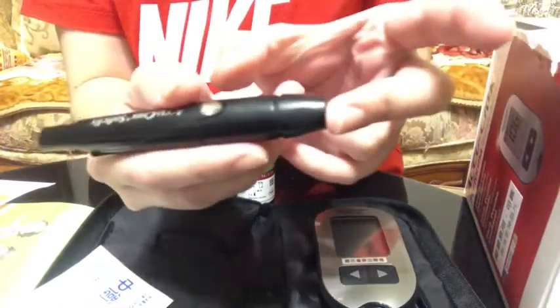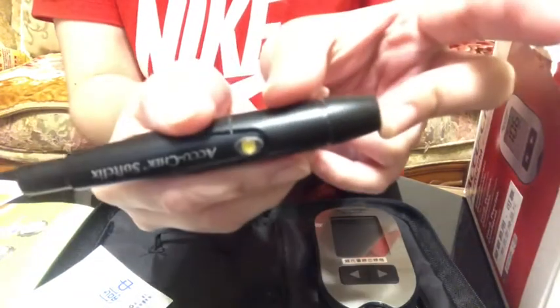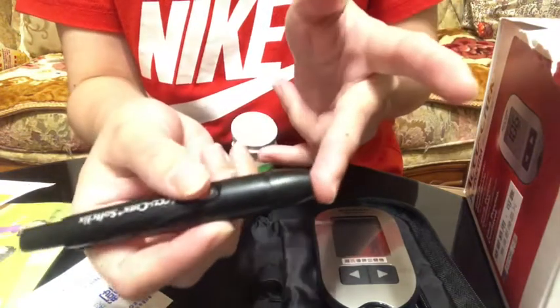This yellow button means the device is ready to use. Just press this yellow button.